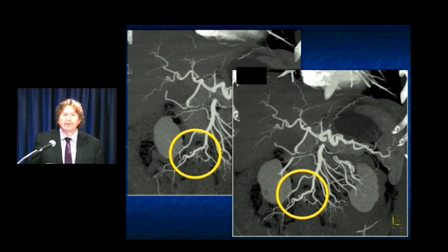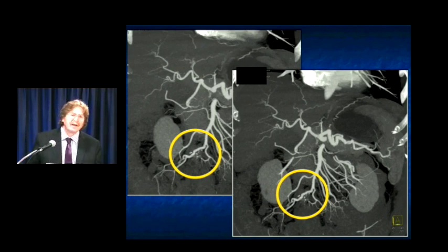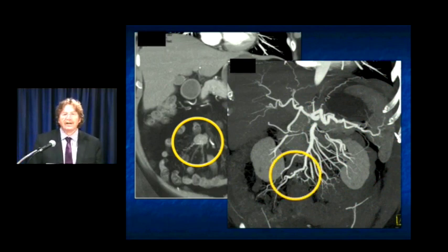Some people do use oral Omnipaque and dilute it even further, so the solution measures, let's say, 60 Hounsfield units instead of 200, which means you put in simply 30 cc's of contrast into a gallon of water. Again, that can be done, and it's something to possibly consider. But you can see when looking for vascular maps, a neutral agent is really going to be ideal. It creates no artifact or problems.